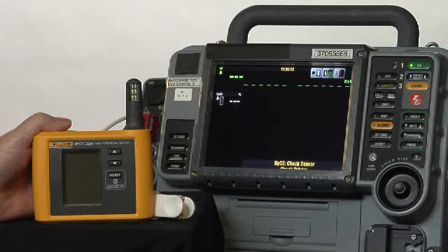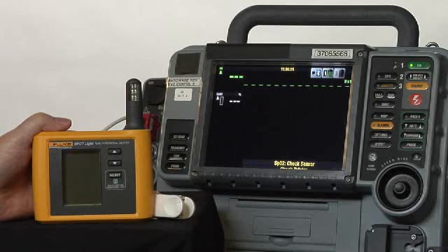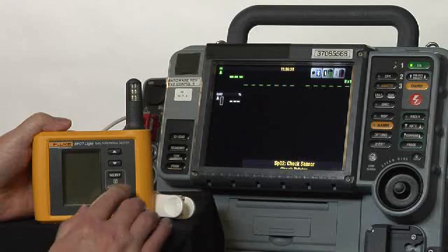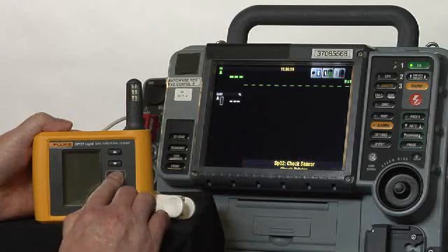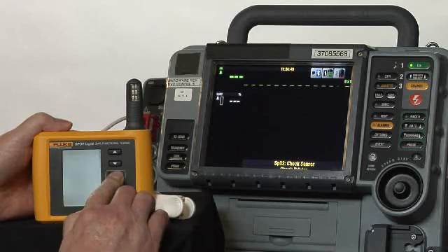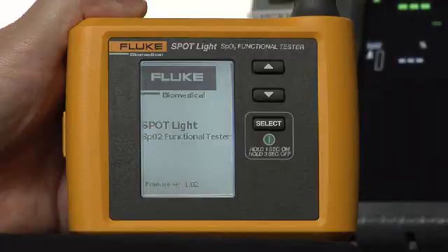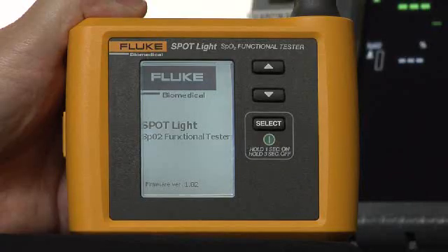In this case, we find the device turned on, it's a defibrillator, and we will turn on our Spotlight SpO2 Functional Tester and wait for it to go through its self-check.